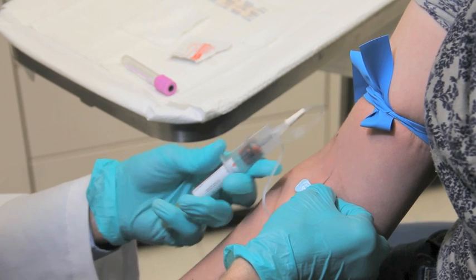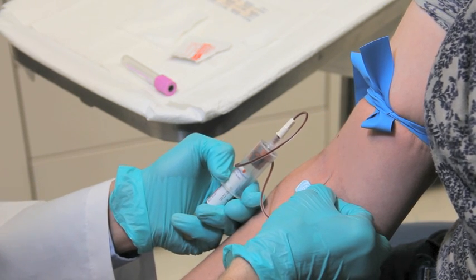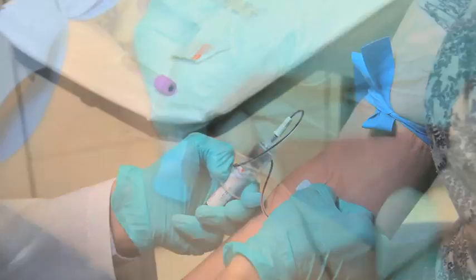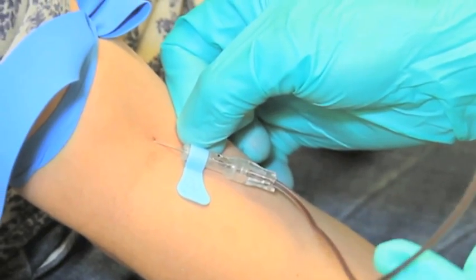Upon seeing the flash of blood, pierce the seal of your first vacutainer tube by pushing it against the stopper within the vacutainer adapter. Since you always want to maintain control of the needle, hold it by its wing and do not let it go. Exerting enough pressure using one hand to pierce the seal of the vacutainer tube can be tricky. However, this can be safely carried out in one of three ways.